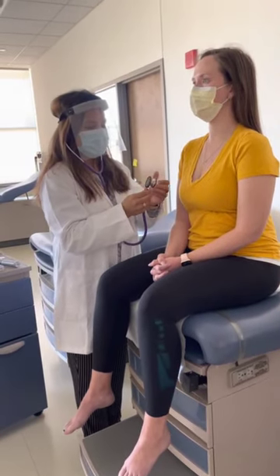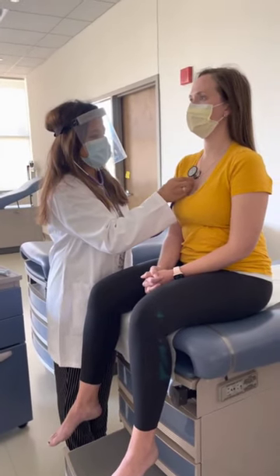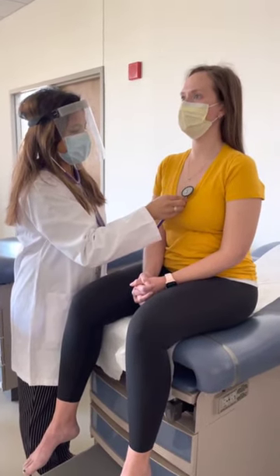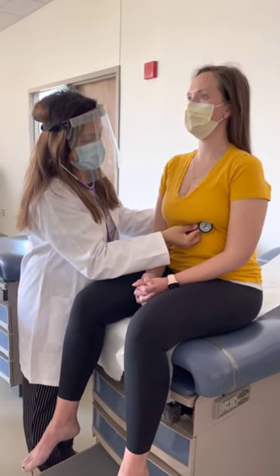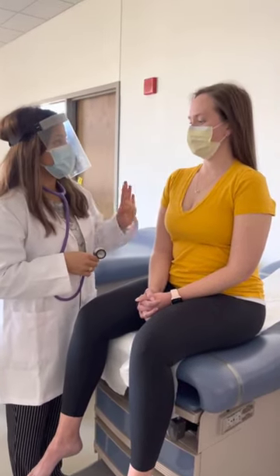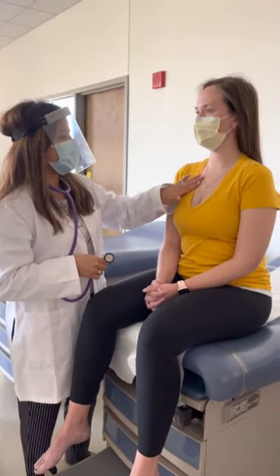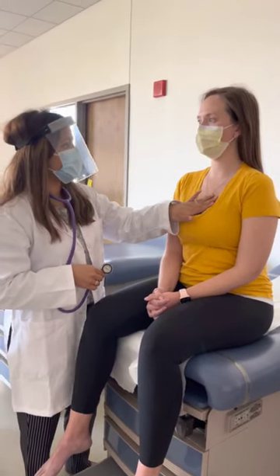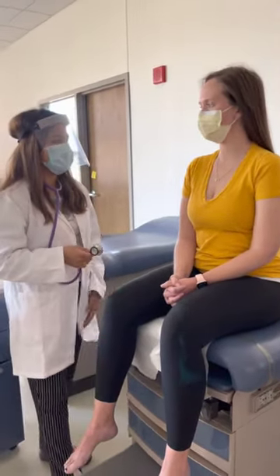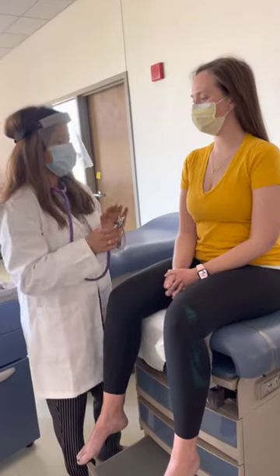I'm switching to the bell of the stethoscope and listening for murmurs. With the diaphragm I was able to hear the heart sounds. S2 is greater than S1 at the aortic and pulmonic. S1 equals S2 at Erb's point. S1 is greater than S2 at the tricuspid and mitral. Everything is normal. I did not hear any murmurs or extra sounds at any of the five points.